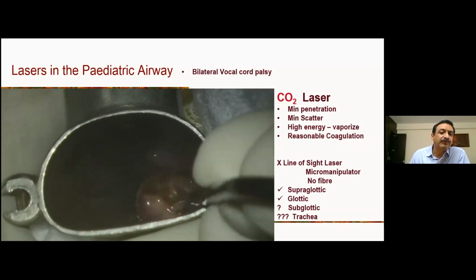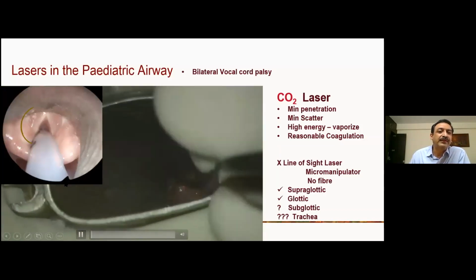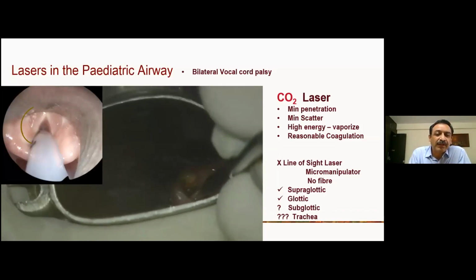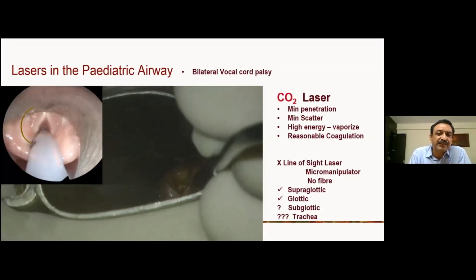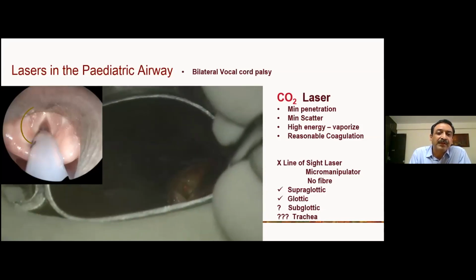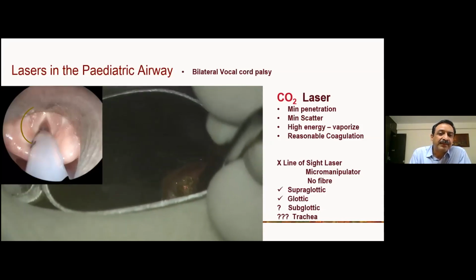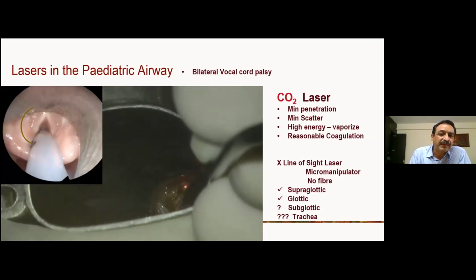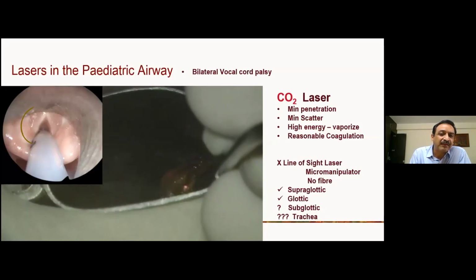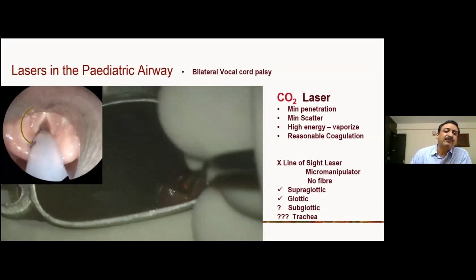Anyway, so the false cord's been cut laterally, and then you tend to move forward in a J-shaped kind of way and feel the paraglottic space muscles of the cartilage or near the cartilage. So you take your incision lateral to the cartilage and then curve it a little bit forward, as you see right here, and separate the anterior muscles of the vocal fold from posterior, and also detach them laterally to allow them to contract. Basically, the thyroarytenoid is going to contract and pull the vocal fold forwards.